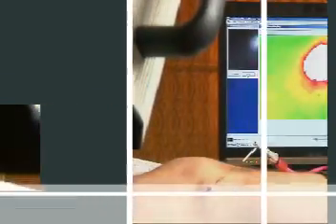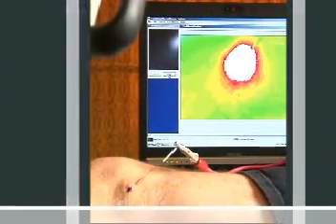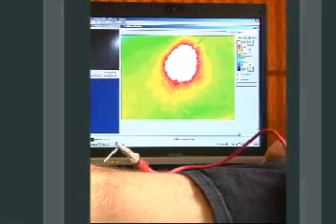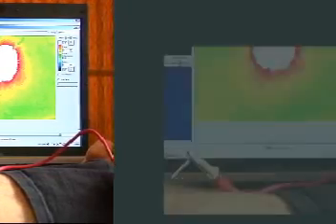Now these probes will put it through. Sometimes it does and sometimes it doesn't. But if it does, it's going to mean nothing more than what you've got there already. Just keep it clean. So once we have about 10 minutes of this it's done. 10 to 15 minutes. Excellent. It's just not intolerable.